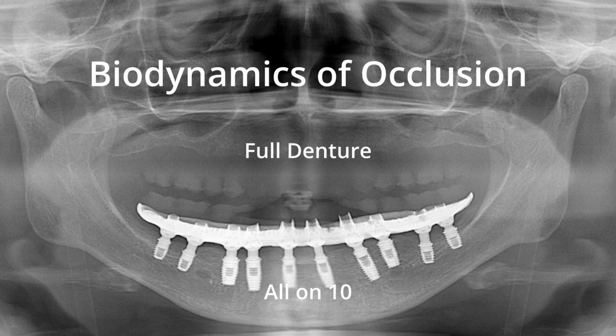When a removable denture is used in the maxilla or mandible, occlusal force increases initially but eventually plateaus. Think about it. If occlusal force continues to increase, the removable denture irritates the soft tissues and causes pain. Patients then come in complaining of pain in the tissues supporting the removable denture. At that point, I already know. I tell them that they probably tried to eat very hard foods or use the denture excessively. Because removable denture patients often come in complaining of pain in various areas. It is not because the removable denture does not fit. They may have been using the denture without problems for years.